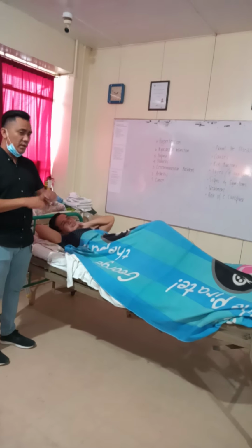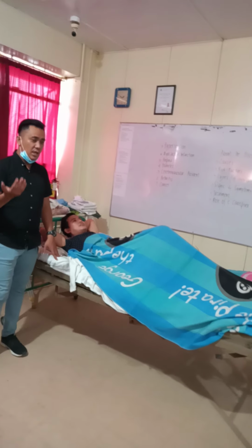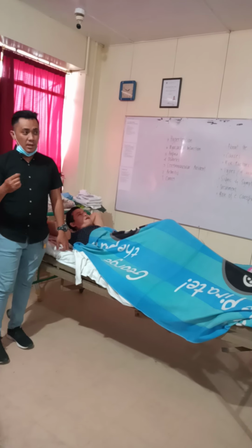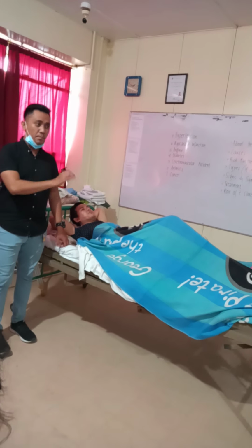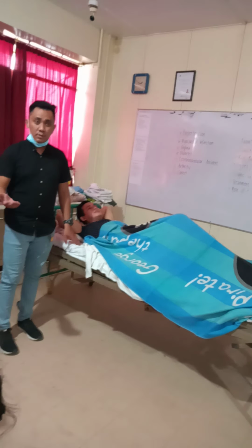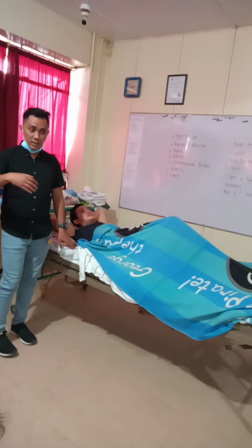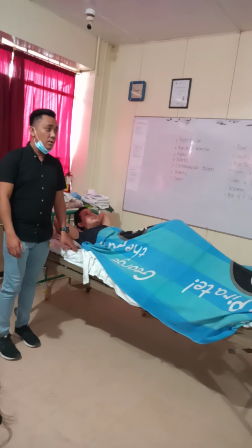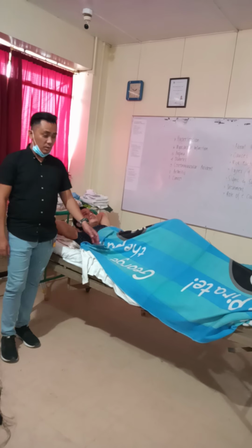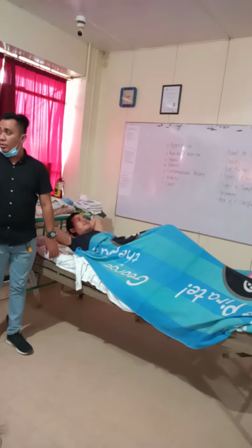For providing privacy, most of the time there are no other people in the room, but if in case there are visitors, much better. But if they are family members, like for example mama, papa, or children who want to assist the patient, much better. Let them also witness or let them assist, so that they will learn, let's just say when you discharge the patient from the hospital.